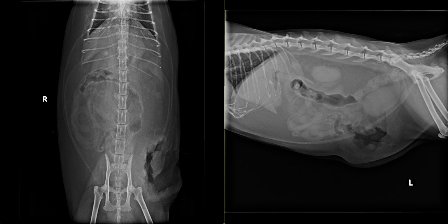Our primary conclusions for this patient are the large inguinal defect without radiographic evidence of abdominal penetration. We do also observe small gastric mineral foreign bodies without evidence of mechanical ileus. There is no radiographic evidence of penetration of the abdomen by the laceration that is also observed in this patient. However, we cannot definitively exclude a small rent and therefore can employ the use of ultrasound to evaluate for internal steatitis or inflammation of the fat in the region of the wound.